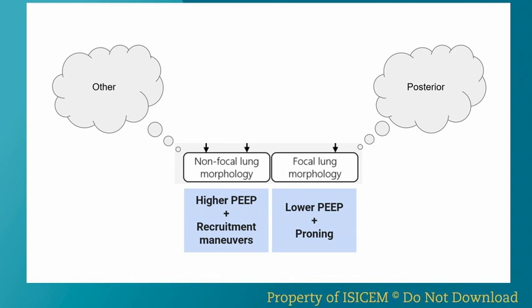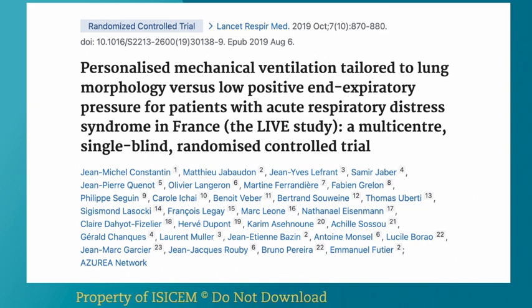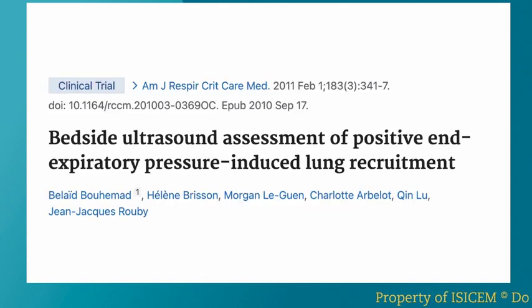Now, when I say could be recommended, I mean this is based basically on a non-ultrasound trial called the LIVE study, in which a signal was found in favor of this strategy, although the original analysis couldn't find that, but it turned out that many patients were misclassified. So there's probably a good rationale of adhering to the strategy, and you can determine this difference by ultrasound, although that is also currently being tested in a multi-center trial.